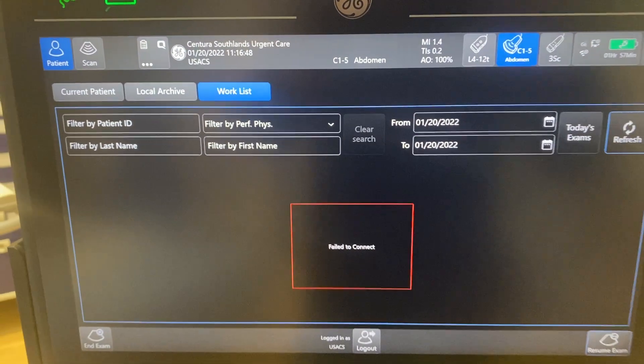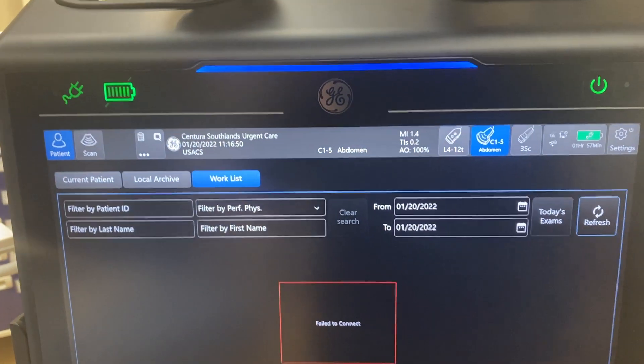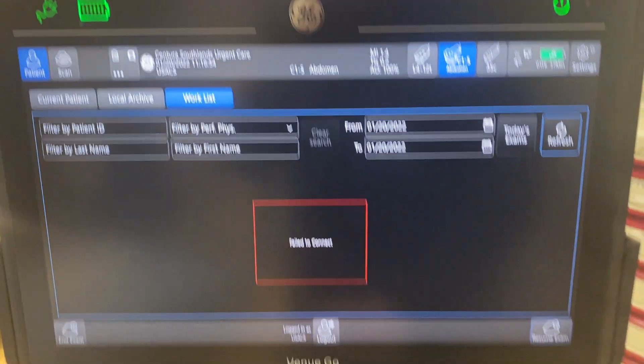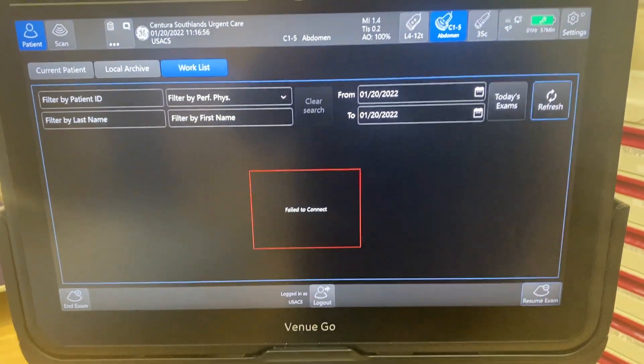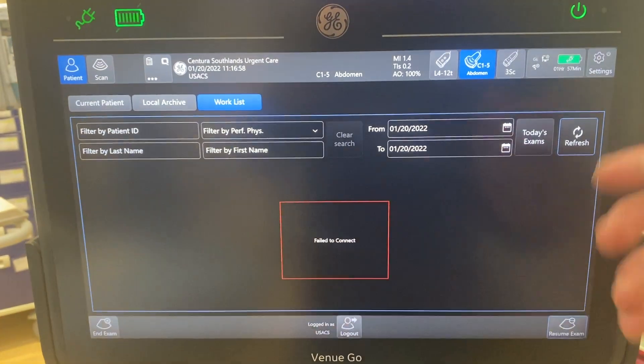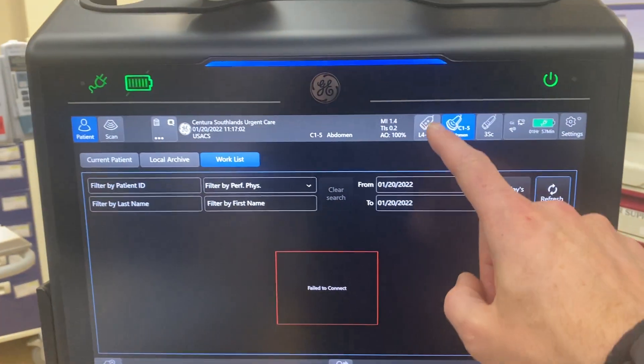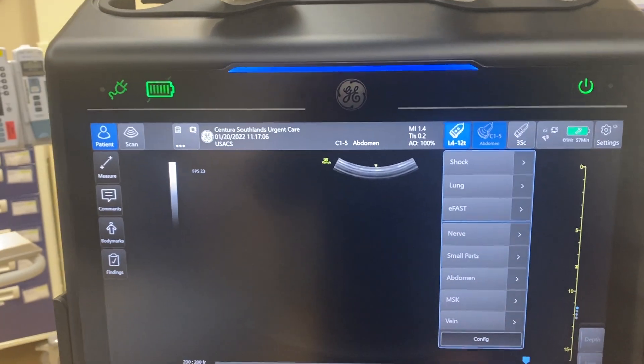Once we log in, if there was a patient here, just like in the other machines, you would have a patient to click on. You would just click on them and then essentially say resume exam and it'll pull the patient's info in and you can start scanning however you want to.